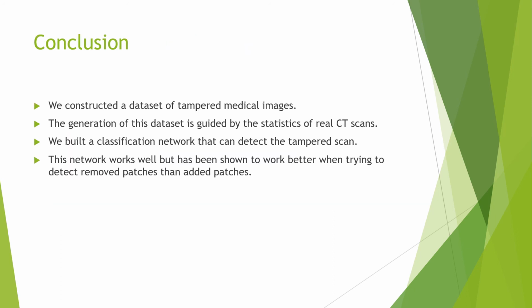In conclusion, in this research, we constructed a dataset of tampered medical images. We generated a dataset that is guided by the statistics of real CT scans. We built a classification network that can detect the tampered CT scans. And this network has been shown to work better when trying to detect removed patches than added patches.